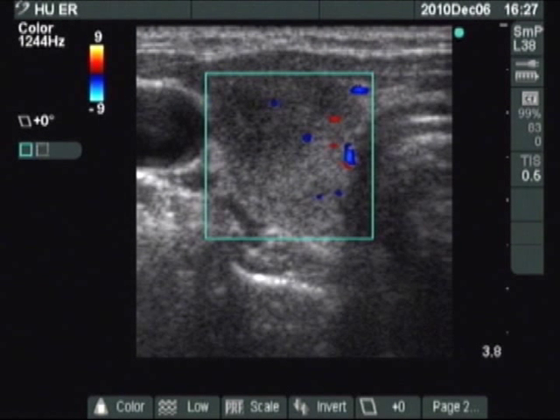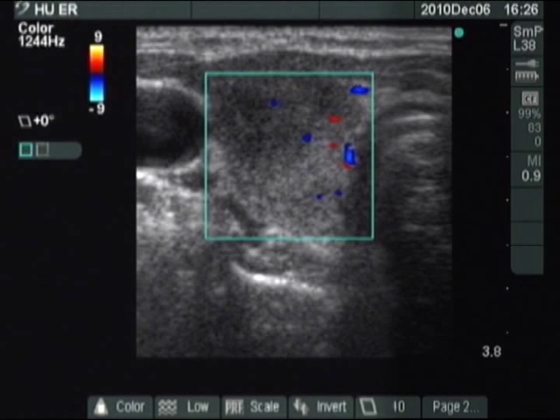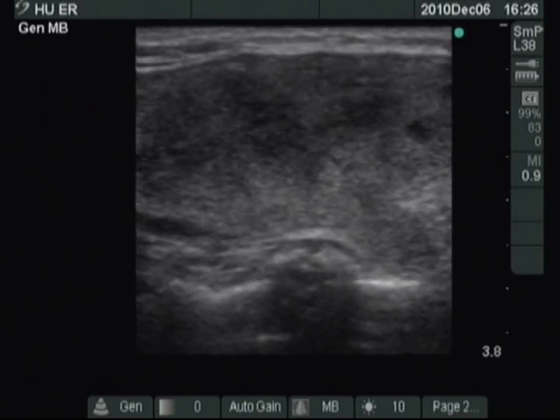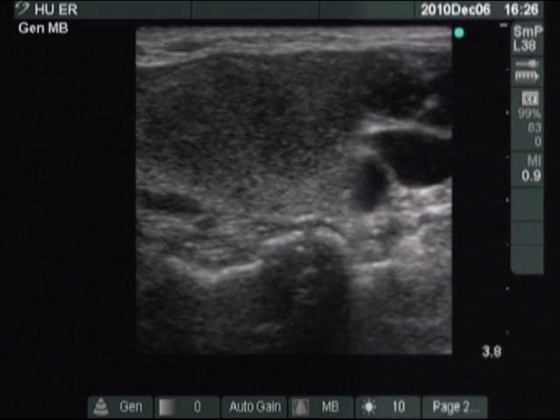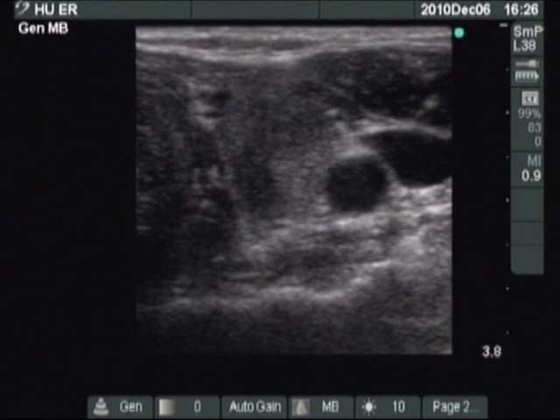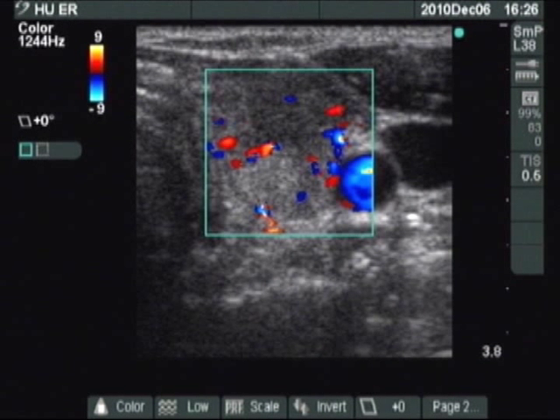The vascularization is absent. One hypoechoic and several more hypoechoic areas can be seen on the longitudinal view in the video. There is a similar pattern in the left thyroid too. The vascularization is decreased according to the hypoechoic parts of the thyroid.